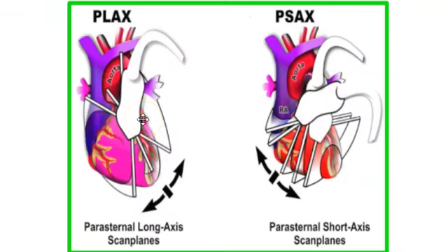In this clip here, we just showed basically how to move the probe if you want to cut through the heart with the Toronto website. We cut through the heart longitudinally this way here, parasternal long axis, and we just tilt the probe, basically tilt this way or that way, or aim the probe that way or this way to see our different views of the heart. And parasternal short axis, we just tilt the probe, tail goes up and down as opposed to back and forth for our cut planes here.